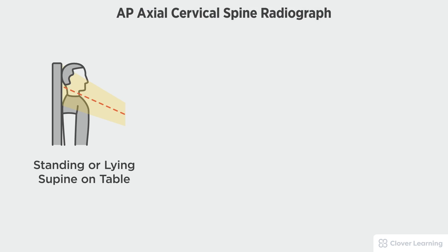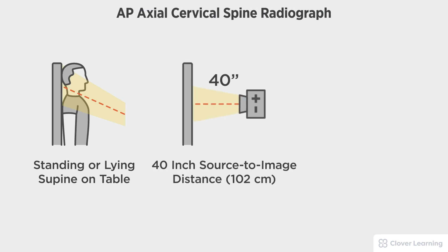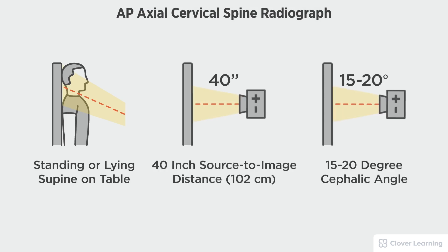In this view we will be demonstrating an AP axial view of the cervical spine. The AP axial cervical spine should be performed with the patient standing at the upright bucky or lying on the table with a 40 inch source to image distance and a 15 to 20 degree cephalic tube angulation.